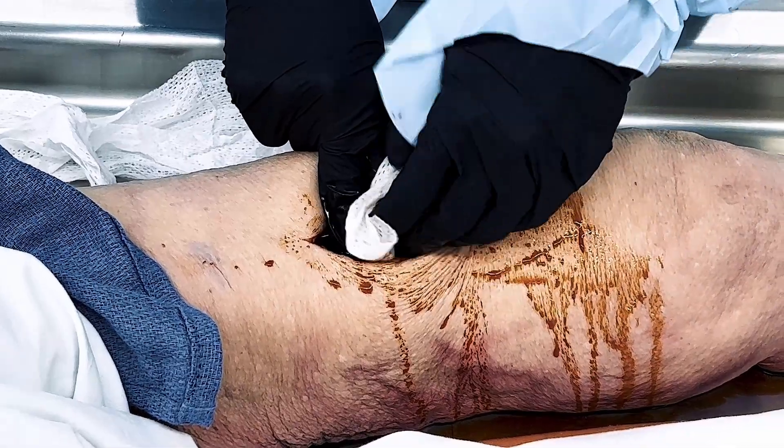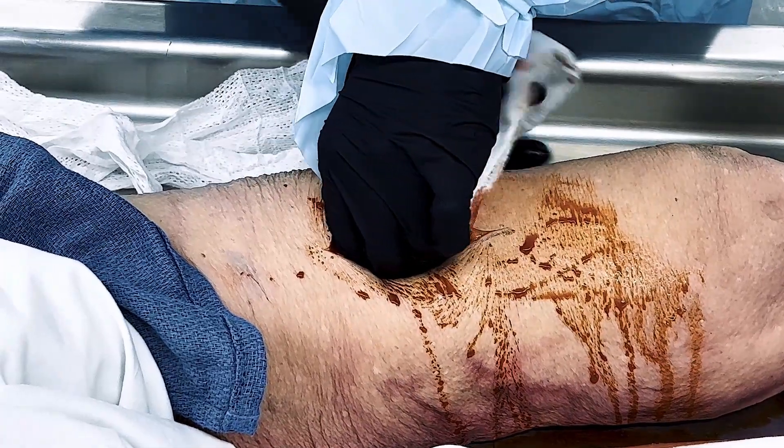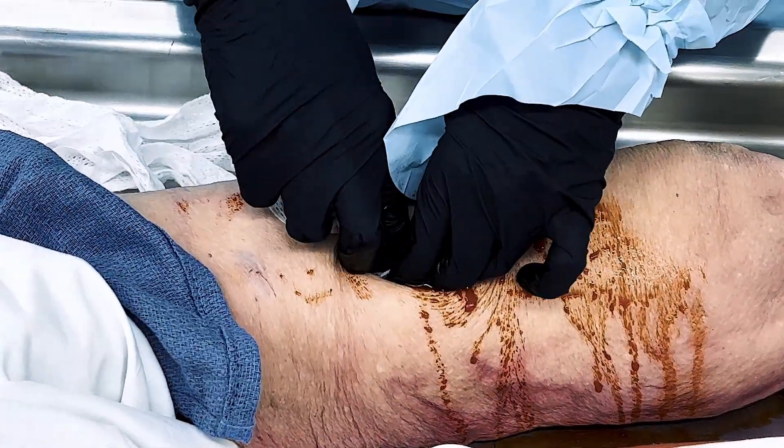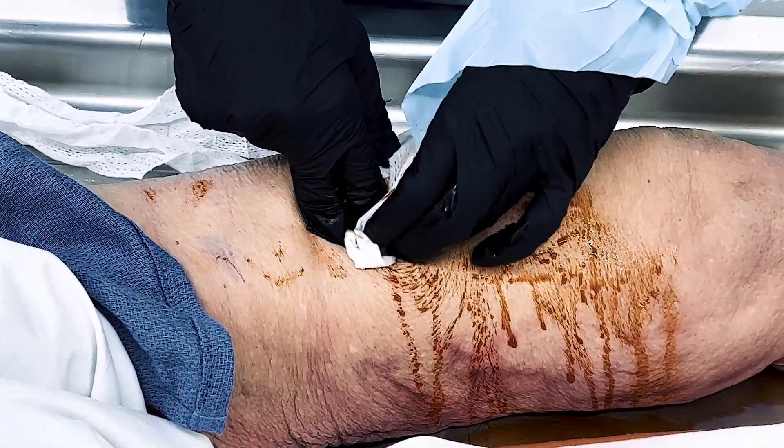A second method can be used. While holding constant pressure with one hand, grab a length of gauze of about two to three inches with your other hand. Push into the bleeding site and underneath the hand holding pressure. Alternate holding pressure with each hand as you introduce the gauze with the other.